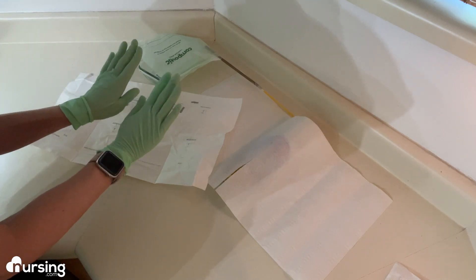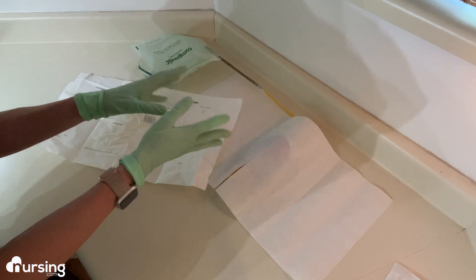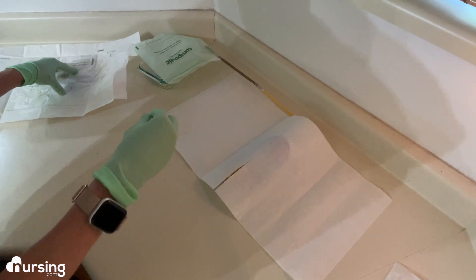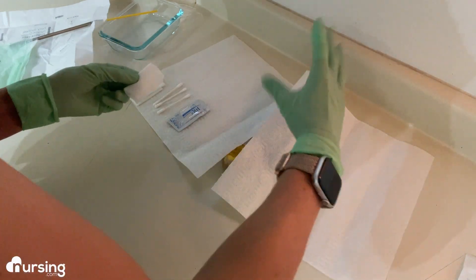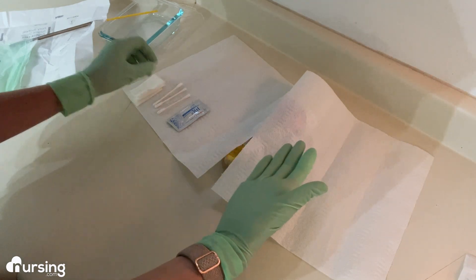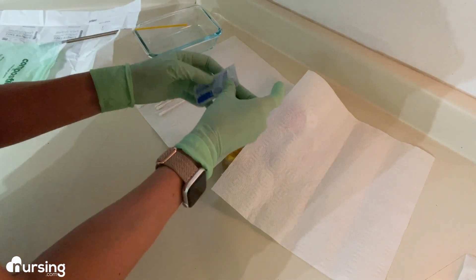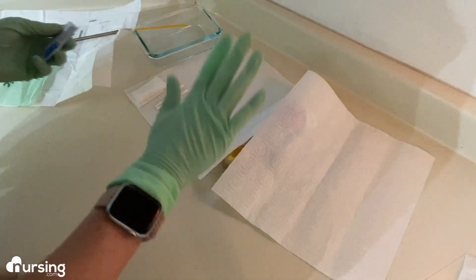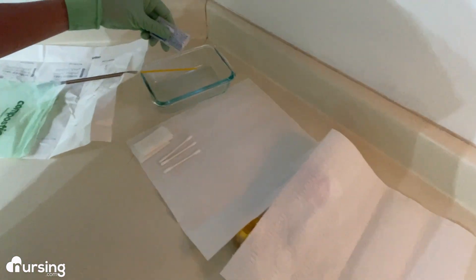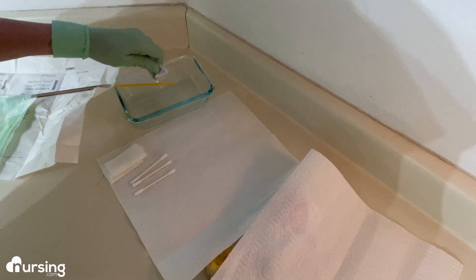Now, good enough with these sterile gloves — I'm not going into surgery, but all of this area that I'm going to be using to prep the patient for this Foley insertion is completely sterile. You're going to commit one hand — I always learned that you commit your non-dominant hand. Something you can do to make sure everything's prepared: make sure that the tip of the catheter is nice and lubricated before you commit a hand and start touching your patient and cleaning. You're going to get that catheter tip nice and lubed up with the lube.